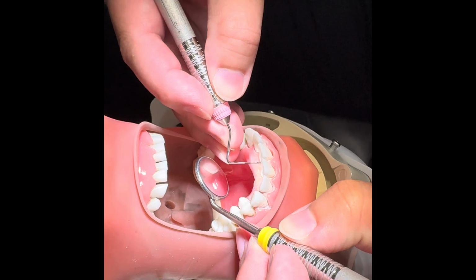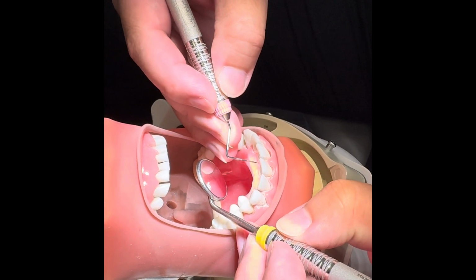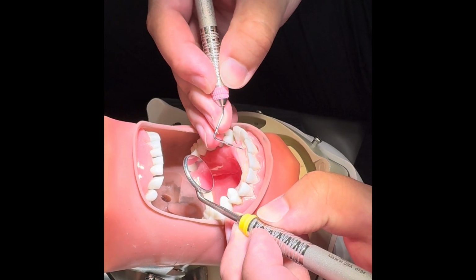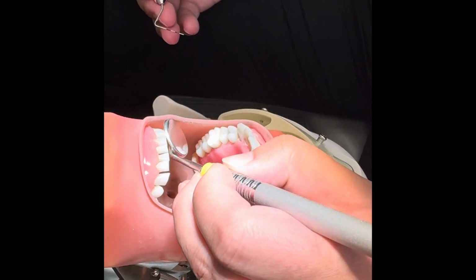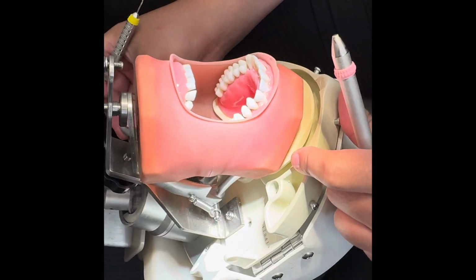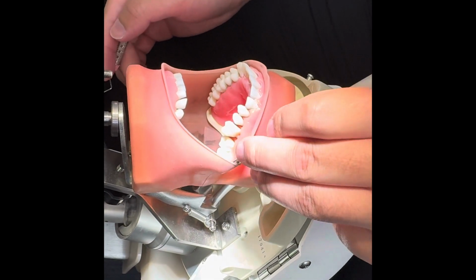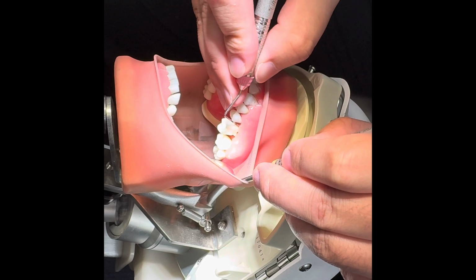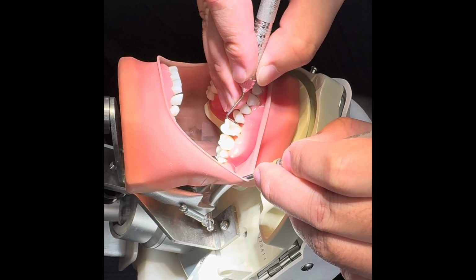Here's a video of me in clinic just probing on the Dexter model. This is on the lingual of number 8. Just making sure you're adapted to the tooth, walking in 1 millimeter increments along the JE. And here we're starting from the buccal of number 14.